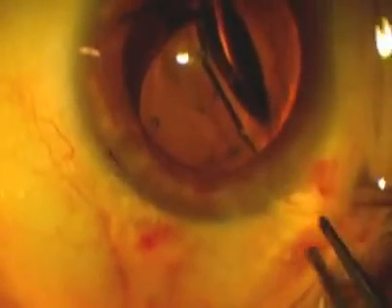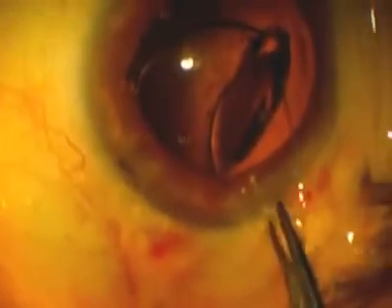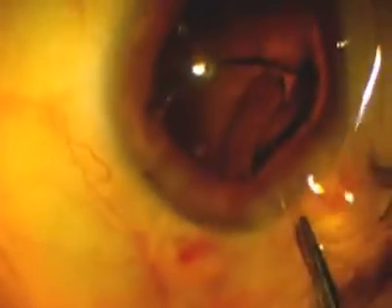And so now using some 0.12 forceps with teeth, the IOL was brought out of the eye. It takes a little bit of force to do this. Sometimes you have to use two forceps to get it to come out. In this case you can see it's still attached a little bit, and that helps you to get the other half out.